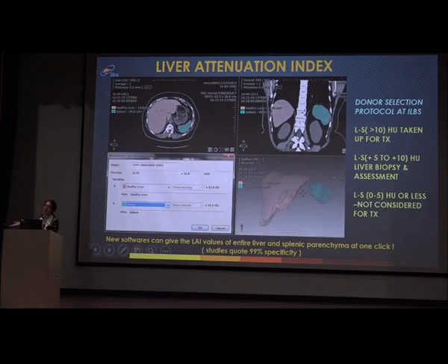Which is the other tissue we can take for calculating CT values? Which other tissue has no inherent adipocytes in it? Which means if you put on fat, which Sir just explained to you, which tissue will not take on fat? Apart from liver, of course, spleen. Spleen will not take up lipocytes, right? Which other tissue doesn't have lipocytes of its own? There are 3 more actually.